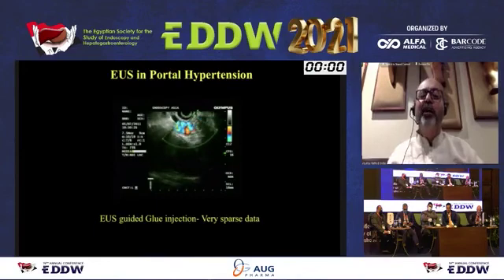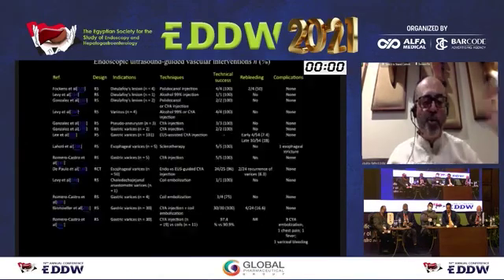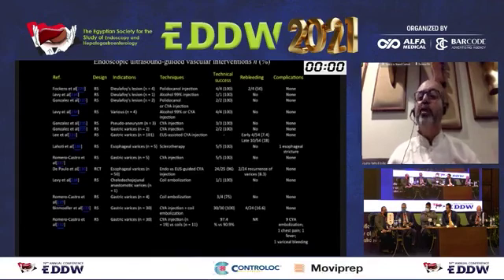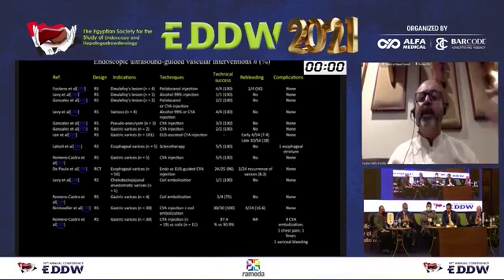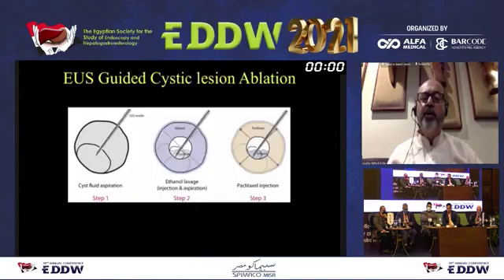So I'm still awaiting a real breakthrough in a multi-center randomized controlled trial, with a technique which tells me to switch over to pure EUS-guided treatment of varices. I'm not going to show in detail, but there have been cases of vascular aneurysms very effectively treated under EUS-guided intervention, coiling, especially the splenic artery aneurysm after a large attack of necrotizing pancreatitis and so forth. So yes, there are some anecdotal cases published in the world literature, and this can be done. But again, as I said, this is still a very, very niche area for research in a large cohort of patients.